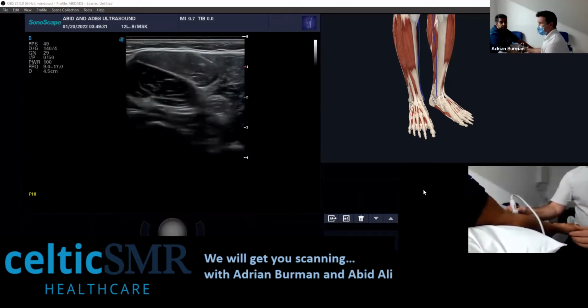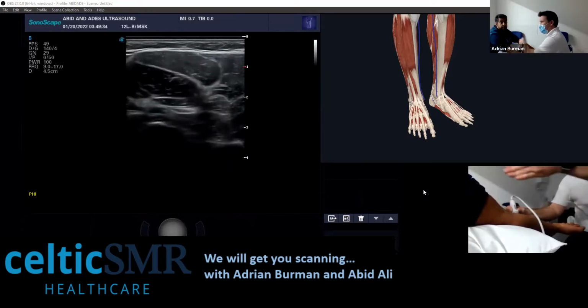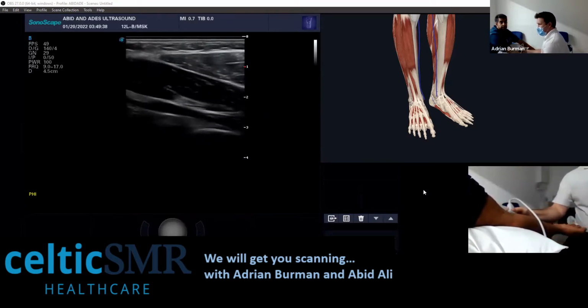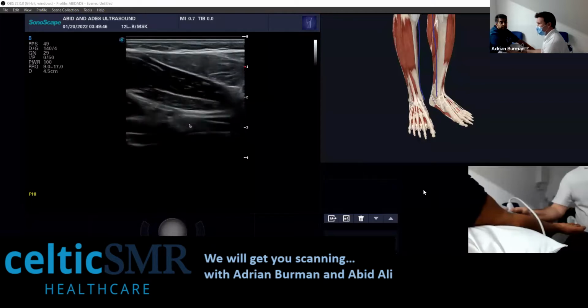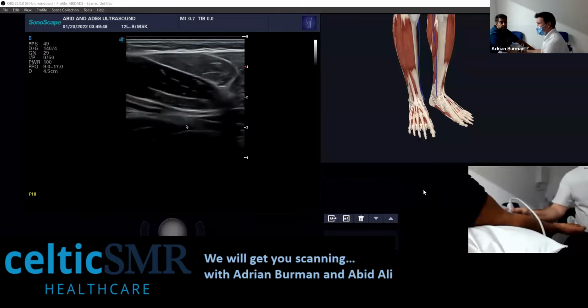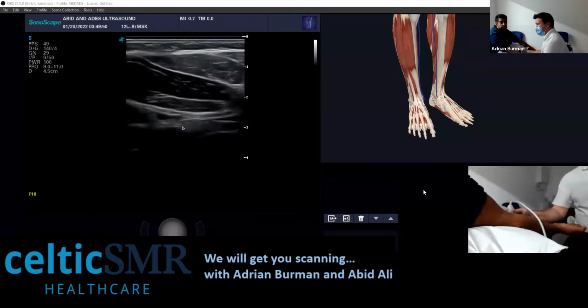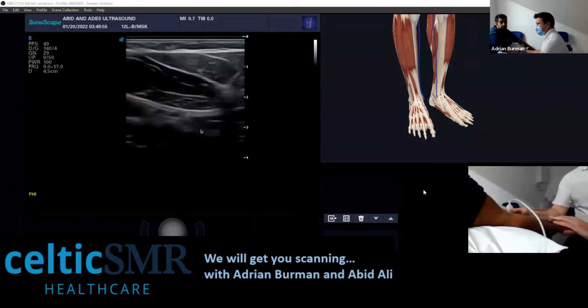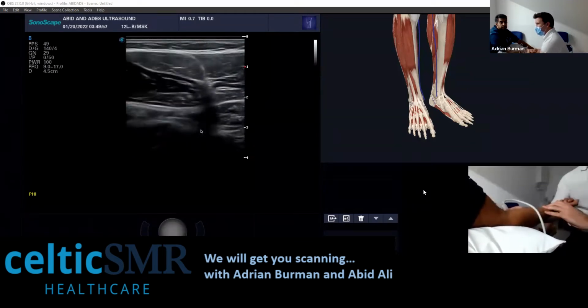Right, rotate round, so I'm going out to the medial side and then turn long section. And there you are. And that brings you right onto it then. And this will be the short head, and then the long head slightly inferior to that. There. Yeah.